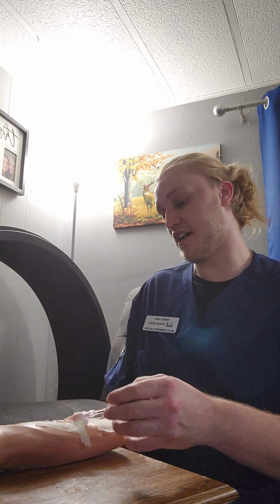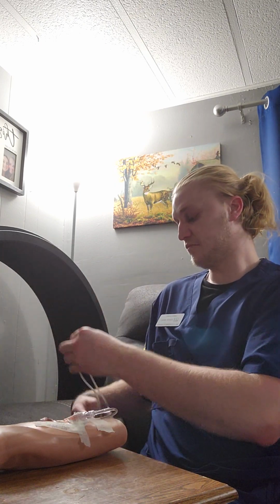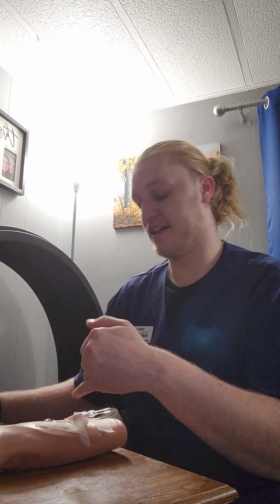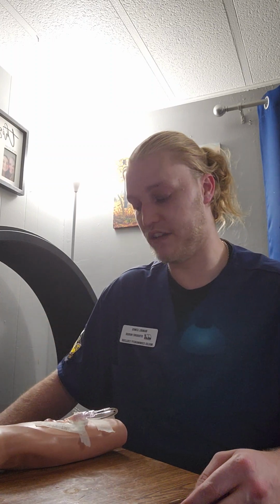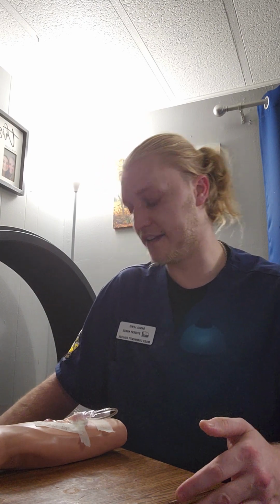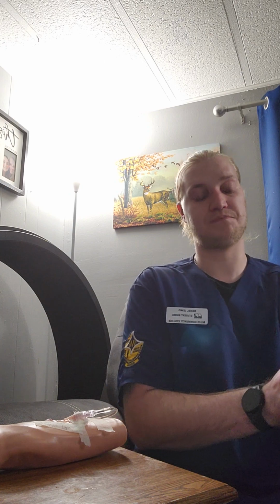Once I do that, I'm going to clamp the IV tubing because it's finished. After I clamp it, I'm going to assess the IV site for any redness, swelling, coolness to the touch, anything like that. Since I don't see anything, I'm going to apply clean gloves.